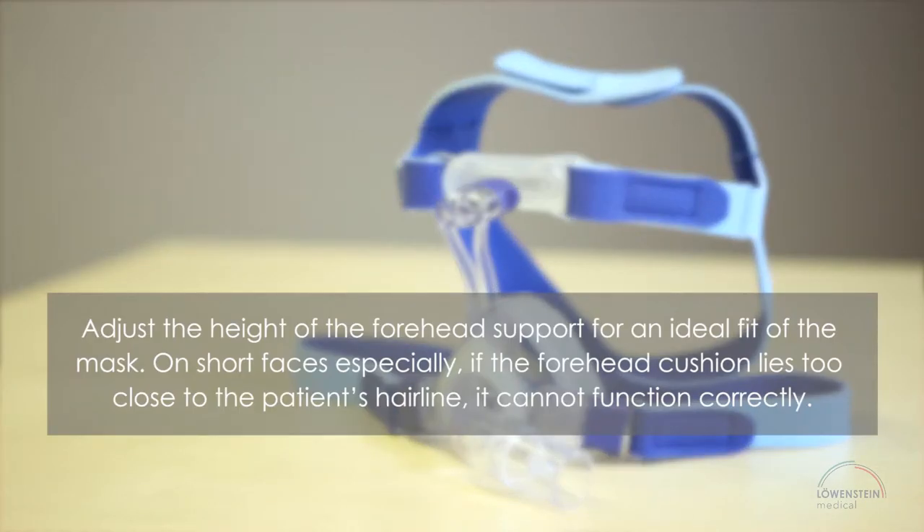Adjust the height of the forehead support for an ideal fit of the mask. On short faces especially, if the forehead cushion lies too close to the patient's hairline, it cannot function correctly.